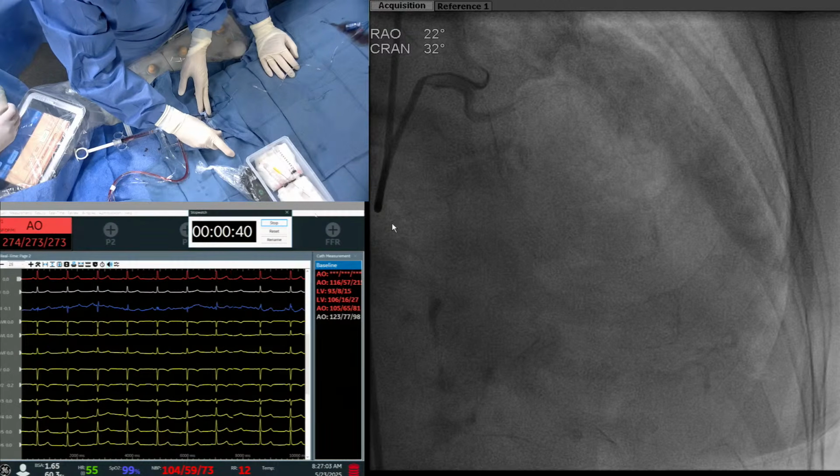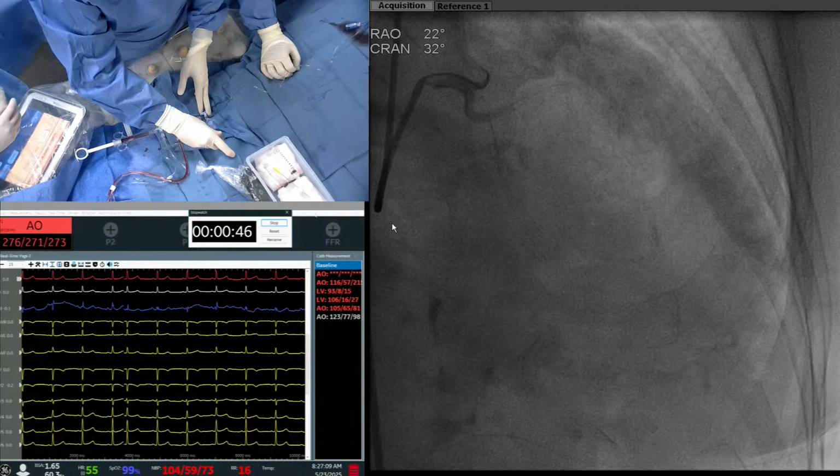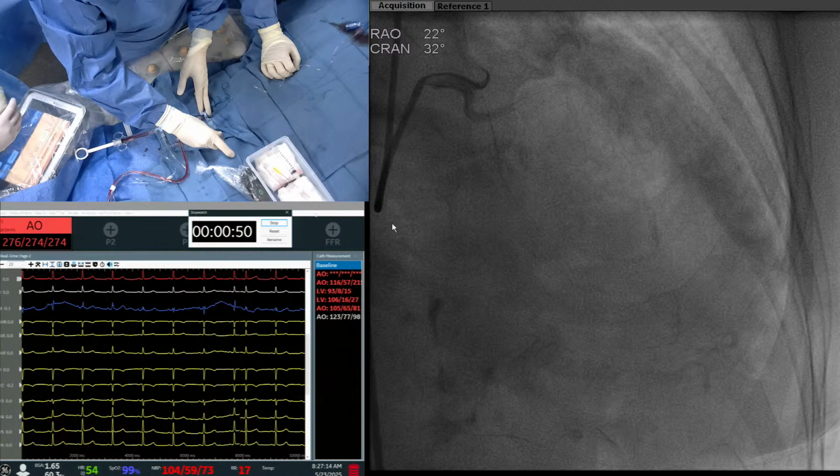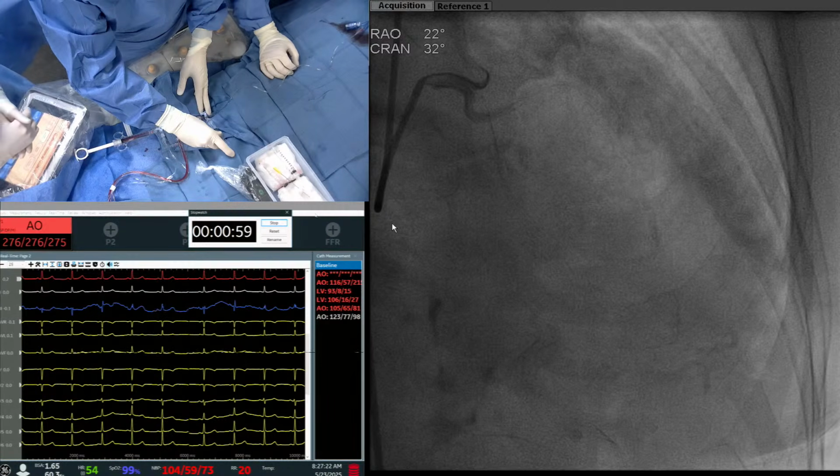And it's all based on your infusion rate. If you see bradycardia or you see a block, you slow down, and then you restart. Pedro Moreno, thank you so much. So the other issue with the EKG is to keep an eye on your ST segment.